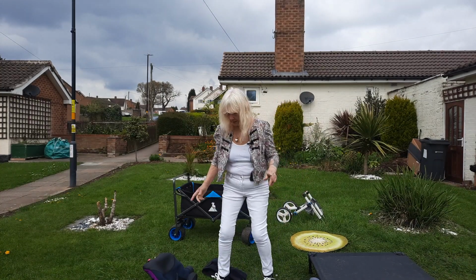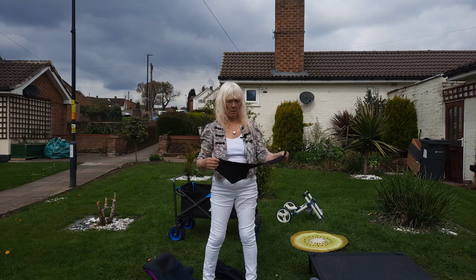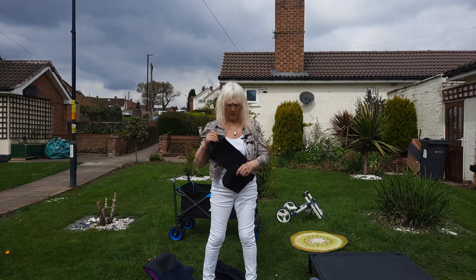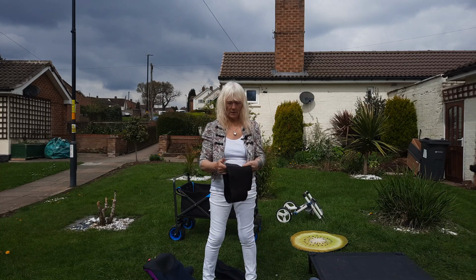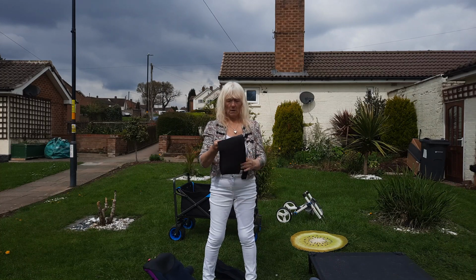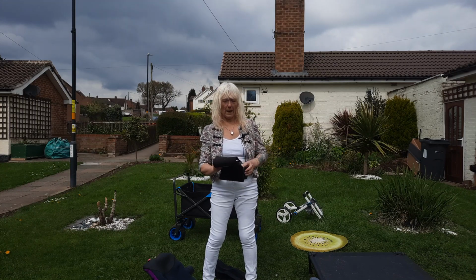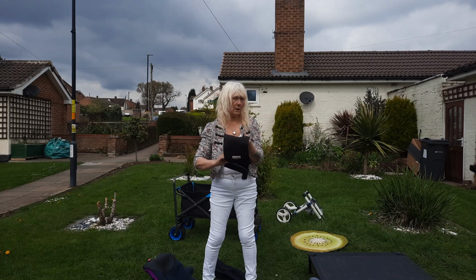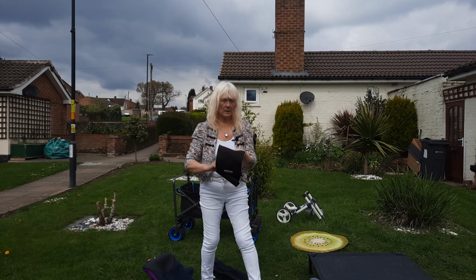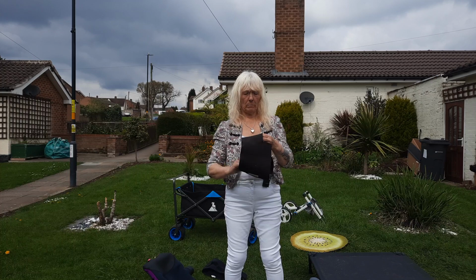Next. Yes. This, you can buy extra. That's a wider belly belt, this one. And I need to tell you something. When you get this, you'll see, this is what we found anyway. That was a hole there, like that. Well, we'd got a boy dog and we found that this was sliding backwards. Well, of course, it slid over his dinky and it was a bit uncomfortable.